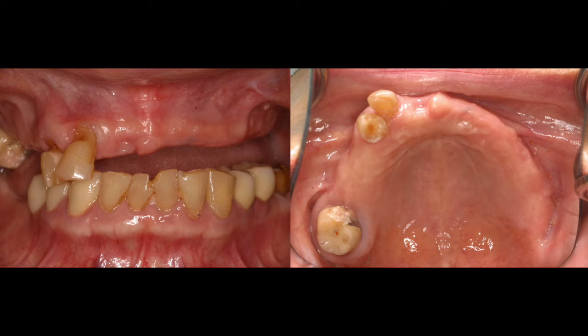When it comes to the immediate, that means the patient presented with existing teeth, but we identify the teeth are non-restorable due to other pathology.